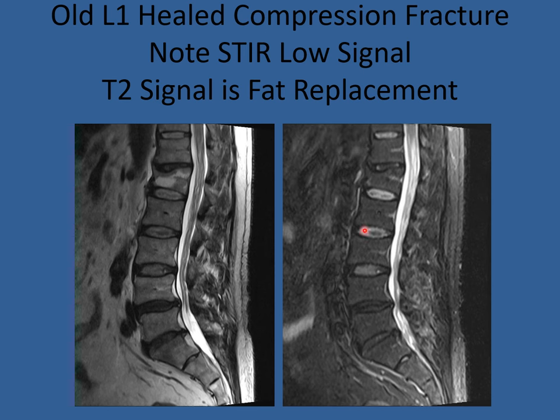We can compare that to an old fracture. On T2, water is white and fat is white, and you can see the signal change in the fracture but aren't sure if it's fresh. Going to the STIR image, you'll see there's no water within the vertebral body — so this is a nicely healed fracture of L1.